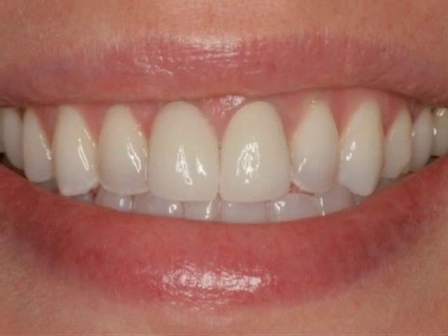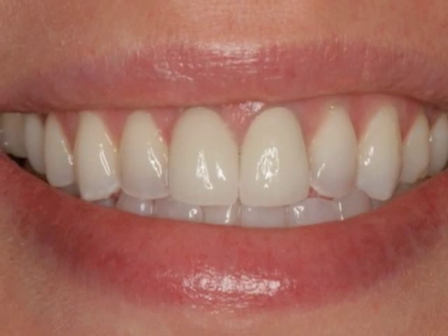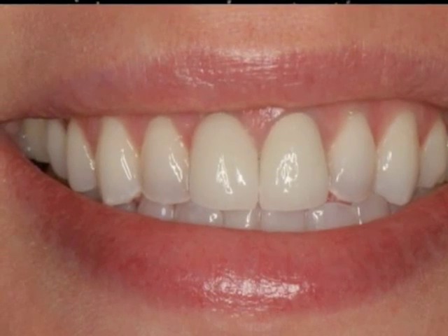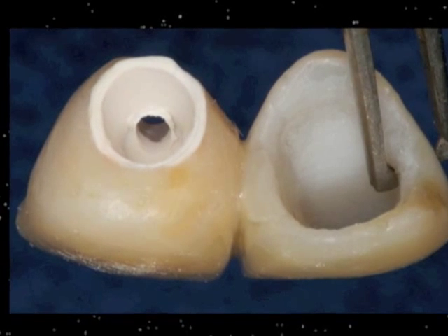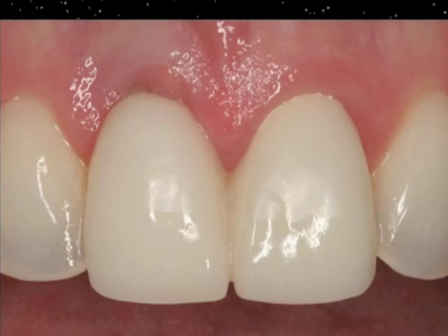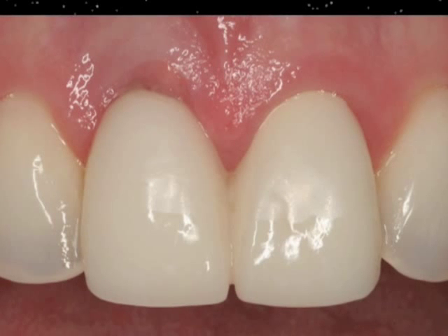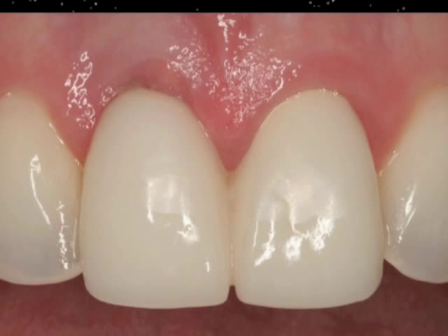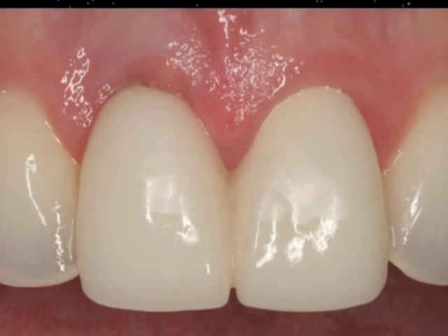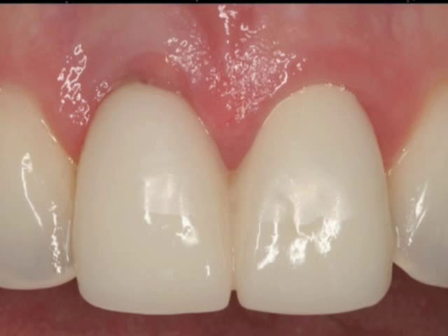Thank you, Vince. I have another question I'd like to address: how crucial is the temporary or the provisional restoration that you make, and how long do you like to typically wait before you place the final crown? The temporary restoration is the key to the success for the aesthetics of the restoration, because the restoration not only is about the temporary crown and the final porcelain crown, but it also is about the gingival contour and the health of the gingiva. So when you're able to place the implant and immediately put a temporary restoration on the implant, you're immediately able to contour and guide the tissue during the healing process to look the way that you want it to look like.